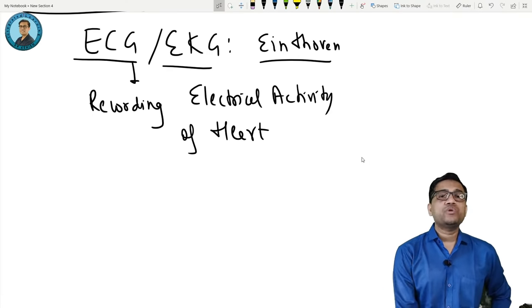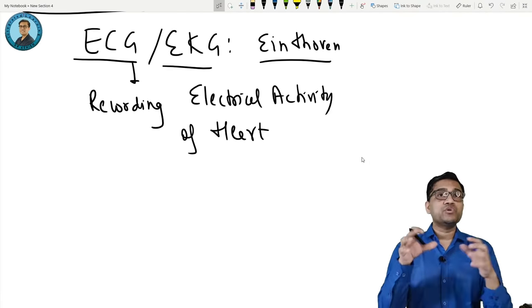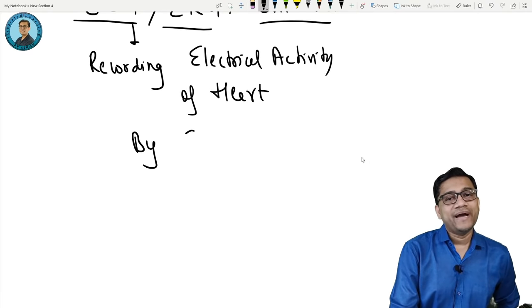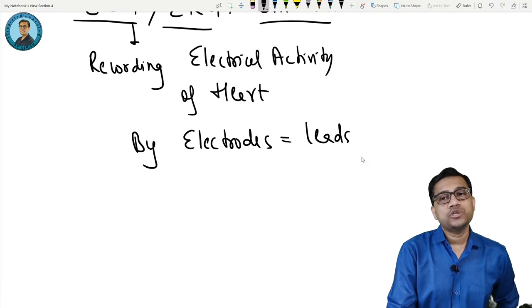Now, to record, the problem is, if you want to see something, we will put something like an eye or something to see. But the problem is, how do we record? So we record by electrodes, also called leads.